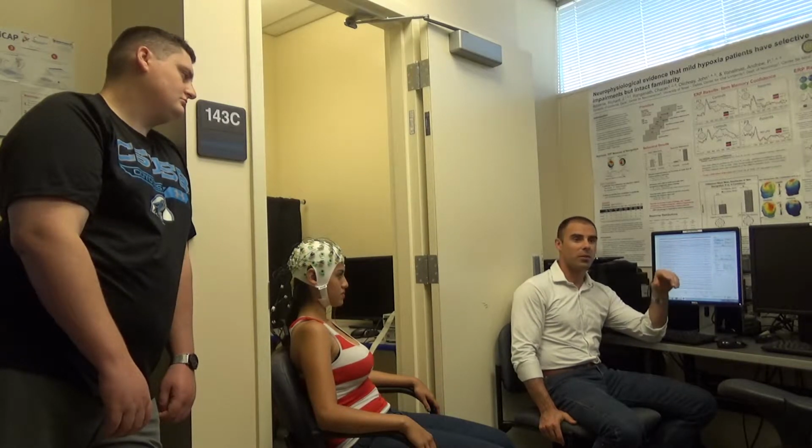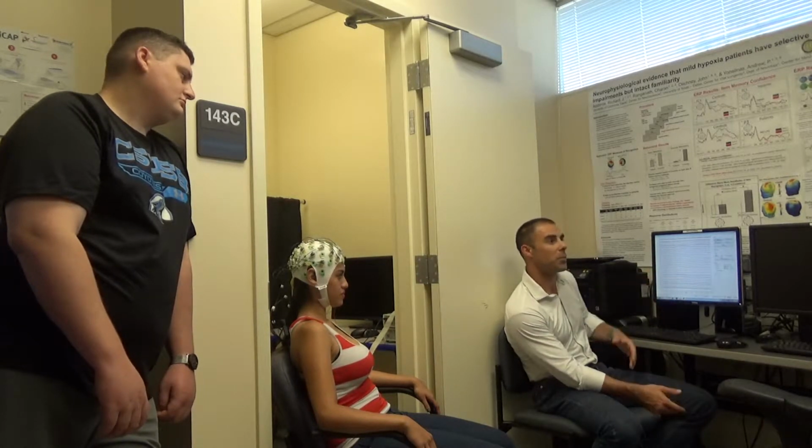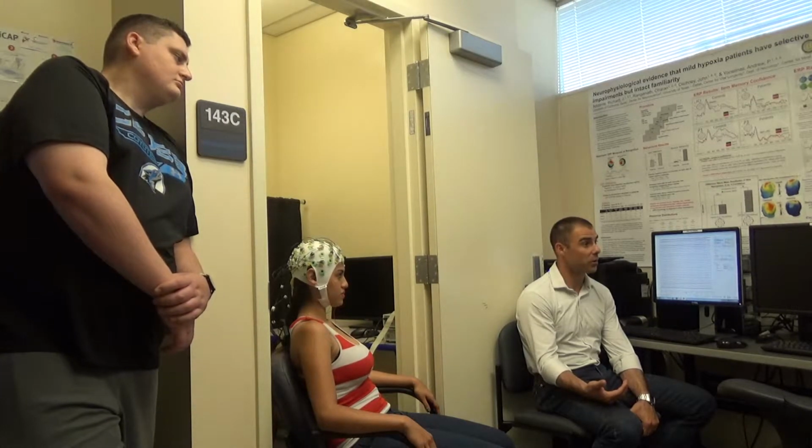So we don't connect these computers to the internet down here, so that people can't be on Facebook and Snapchat or whatever during the experiments. That way you can sit here and look at this during the experiment and really not be distracted, so that we don't miss some of those little things that might be happening. So if she starts blinking, and it's during the phase of the experiment where they're not supposed to be blinking, you can see that and say, hey, by the way, I noticed that you let a few blinks slip in there. Remember, we really need you to do your best.